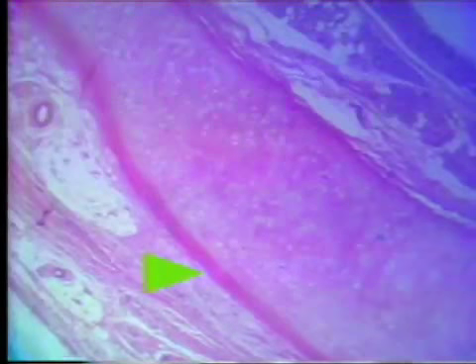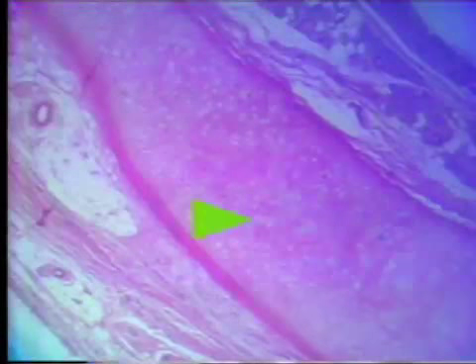In this case, it forms a fibrous connective tissue covering on the periphery of this piece of cartilage. Even at this power, you can see the groups of cells, the isogenous groups, and the different staining characteristics of the ground substance, the so-called matrix. Now we're going to go to a higher power, see some more of the cell detail. Notice the cytoplasm is washed out, and all you see is the nuclei.